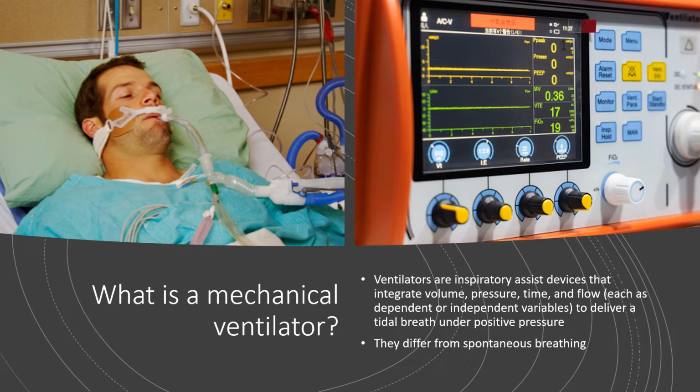There's a big difference between positive pressure ventilation that a patient gets from a mechanical ventilator versus spontaneous breathing. They are completely different modes of operation. I would strongly suggest that any patient who's on mechanical ventilation, if they could spontaneously breathe, let them do some of their own spontaneous breaths. You don't want to take their respiratory drive away. You really want them to sort of work.